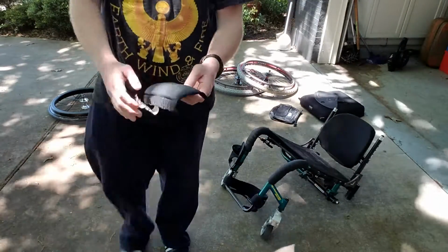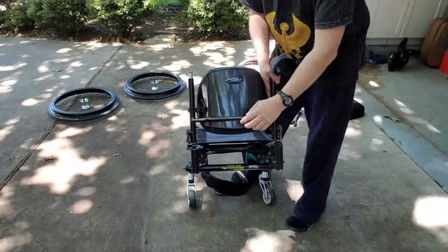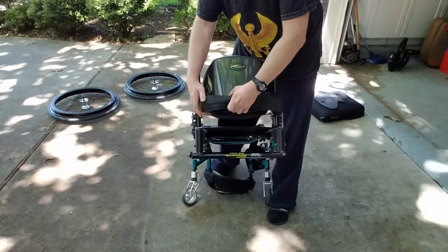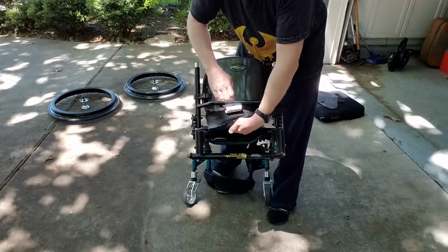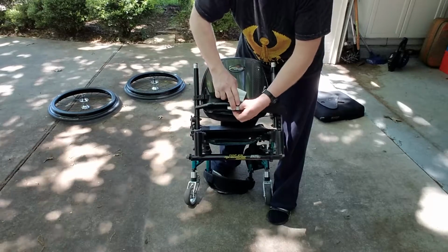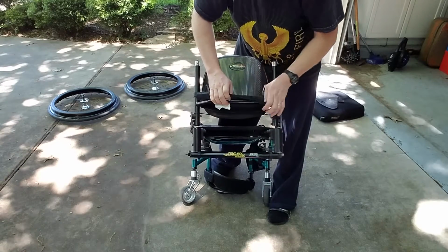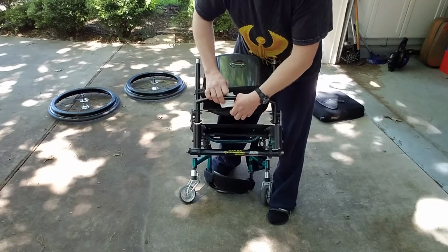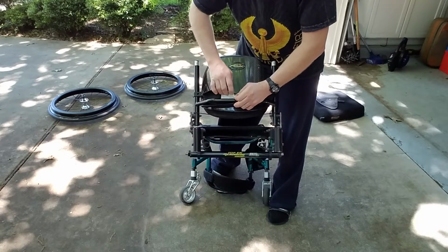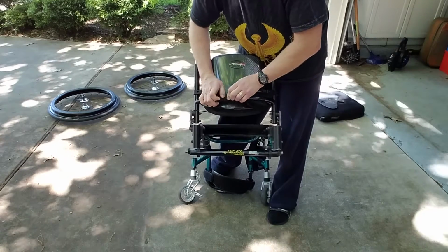There's one other foam pad. This goes in the back on this crossbar right here. And it just wraps around like the other two do. Toughest part is just dealing with these tags. You have to get them out of the way so that the Velcro has a place to attach. But again, once this is on, you don't ever take it off. It just stays on the wheelchair all the time.